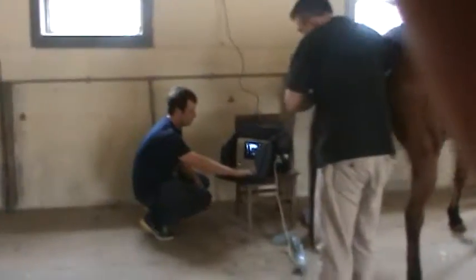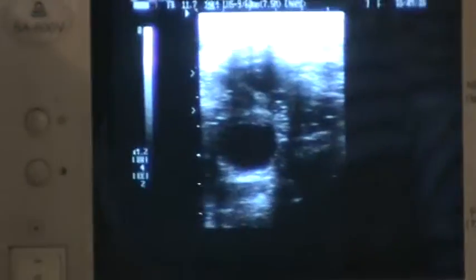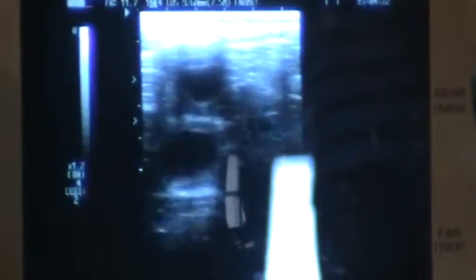Scanning over it, unfortunately, it's just those grape-like structures, those dark spots that are black. You know what I mean? They're fluid-filled structures, and those are follicles. But there's not a CL over here on this ovary either. So that means she's probably going to cycle, like we said. There's another small follicle here, about a 25, that will be growing at the same rate. So her uterus is not going to be that remarkable because she's not in heat.